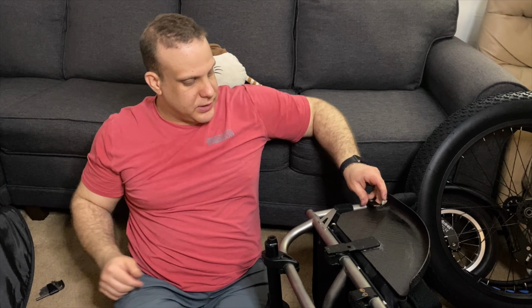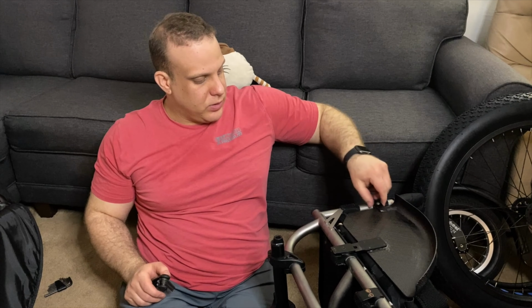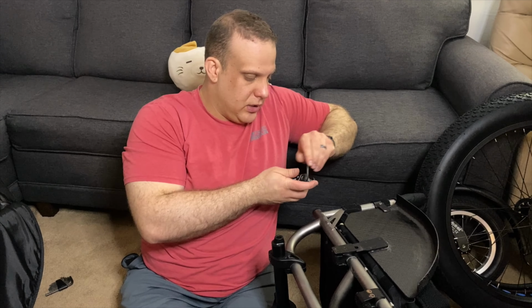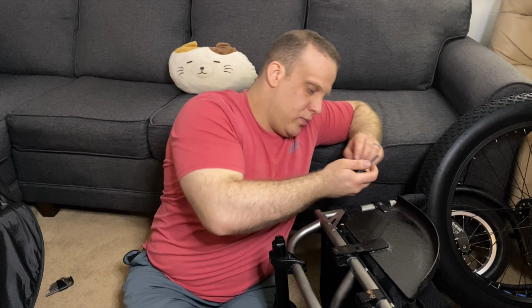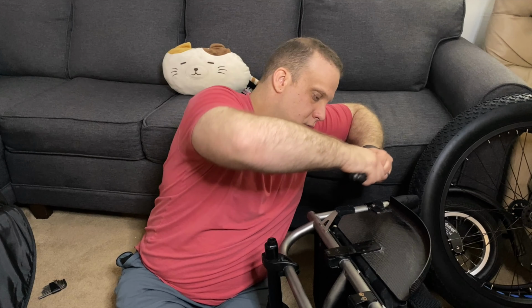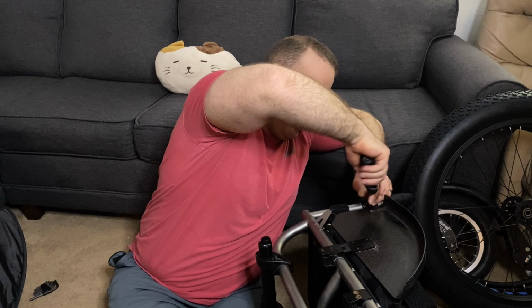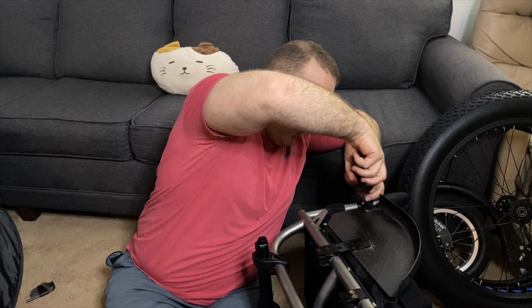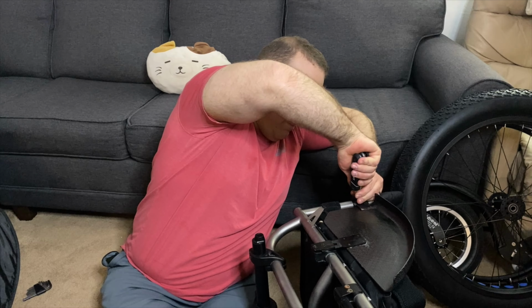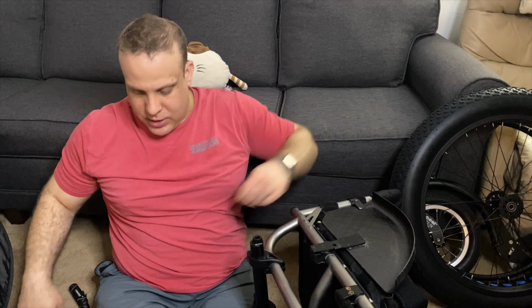I have these little tabs from the Tie Light that are actually quite neat, that stop the side guard from flipping out or getting pressed out. And I loosened that too just so it didn't get in the way. So I'm just gonna retighten, oops, that's the wrong one. I'll retighten that bolt real quick, or a screw, whatever you wanna call it. It's probably a screw. So now that's tight, side guard slid up.